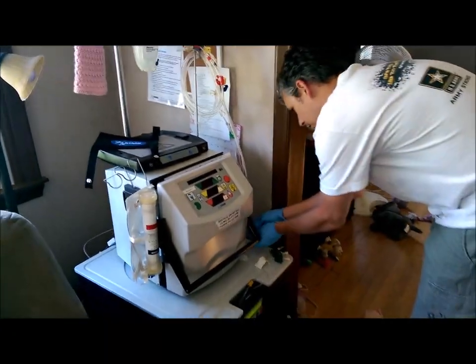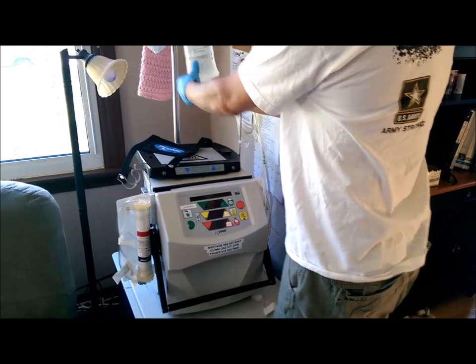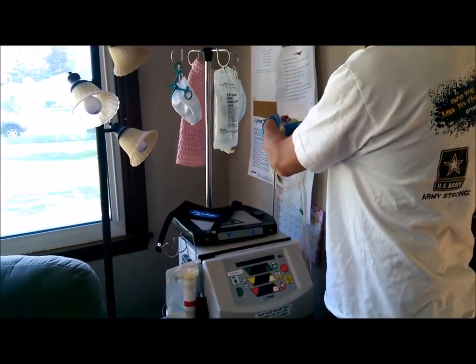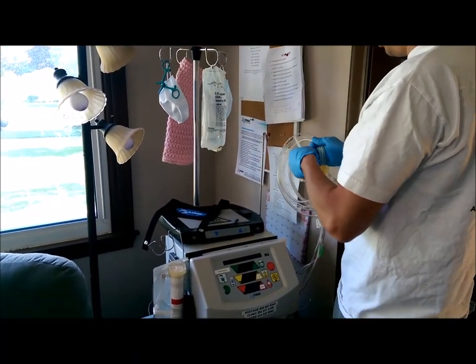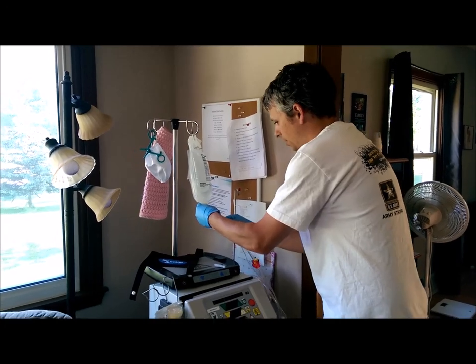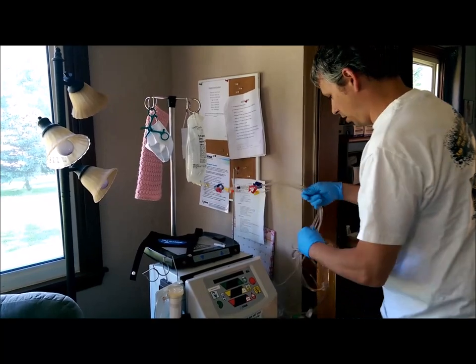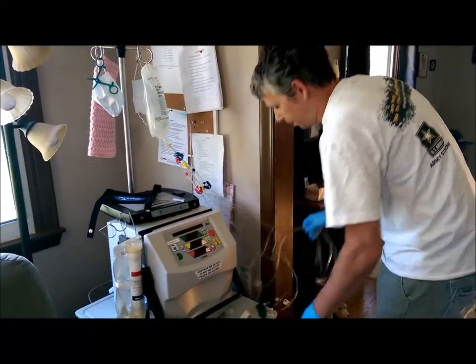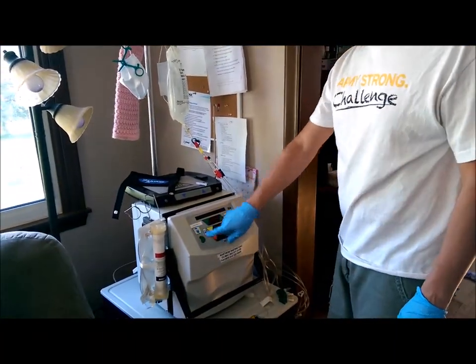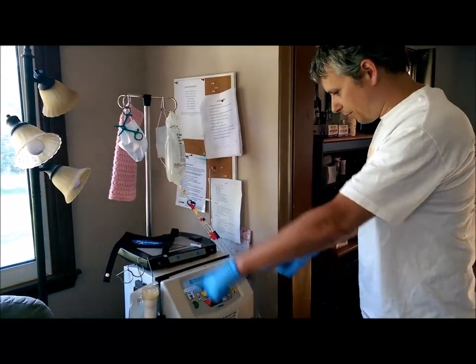There are a couple of connections you have to make first, and then we hook it up to this saline bag. What we're doing now is called priming the machine — we cycle the saline through everything and get it ready. It takes 15 minutes exactly, no more no less. Press this button and it'll go through its self-checks and tests for 15 minutes, pulling all the saline through and getting everything ready. So now we wait.